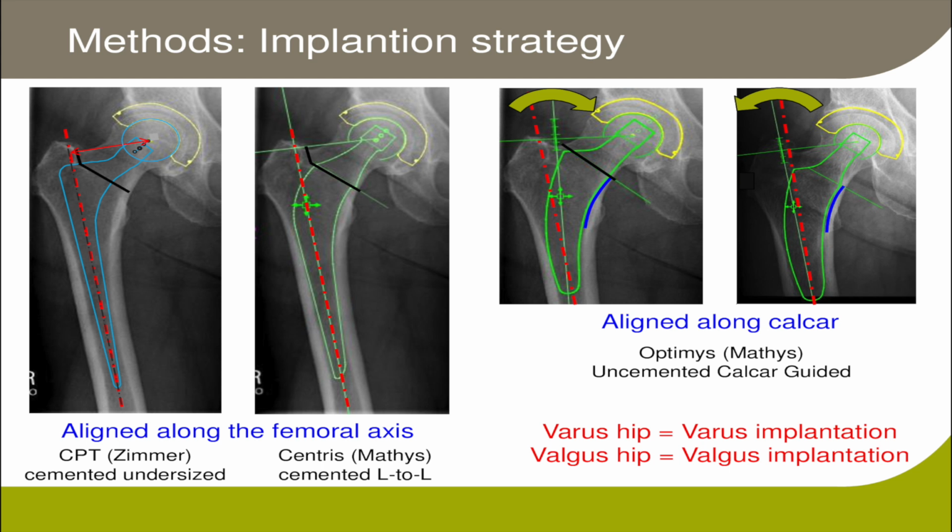Here also, taking into account that this was an uncemented stem and that there we needed a maximized cortical contact, which was not the case, of course, for these cemented implants. They can be cemented wherever you stop or you want to stop them. They will be fixed at that level. So there are much more opportunities to position the stem in a cemented version compared to an uncemented stem that needs to have stability through direct bony contact.